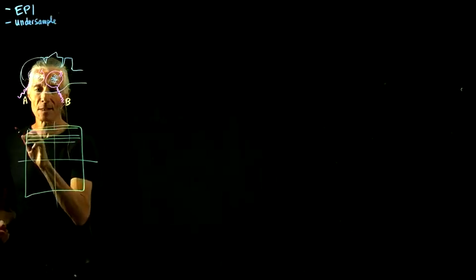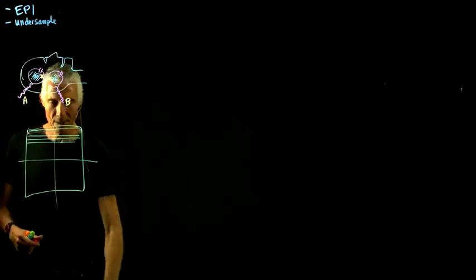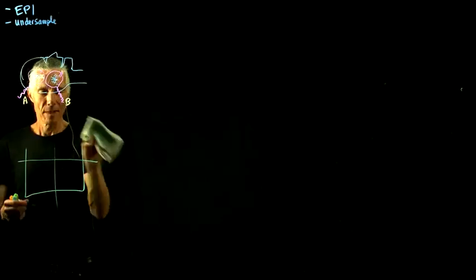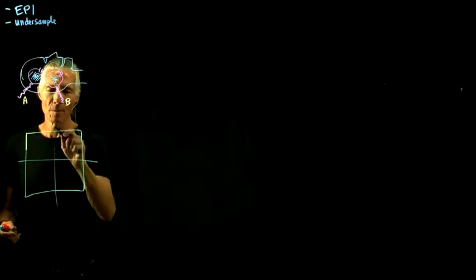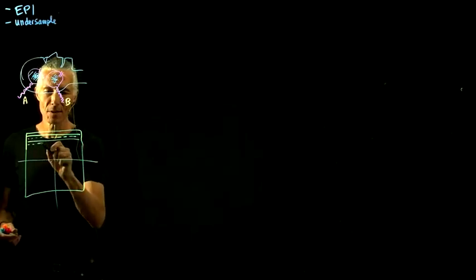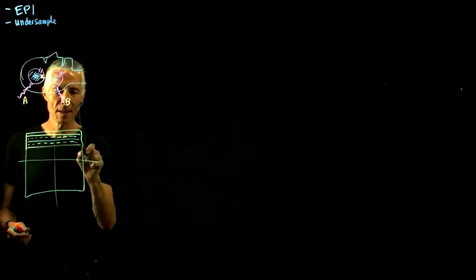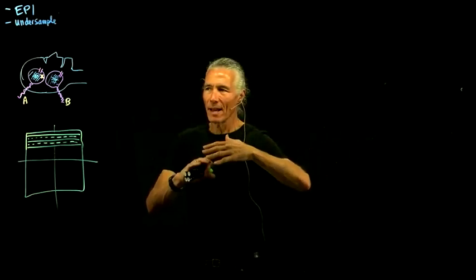A lot of times we can say that we're zeroing it by just making a dashed line. So start with a Fourier transform of a brain, and then leave that line, take out this one, leave that line, take out this one, leave that line. What happens if you do that is you'll immediately have the field of view problem.